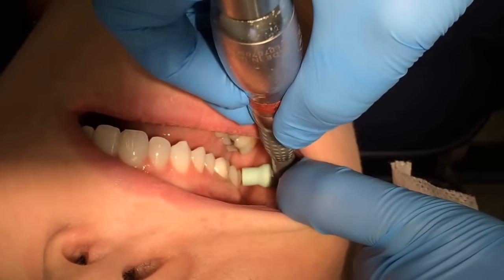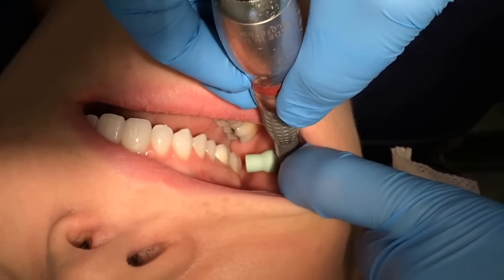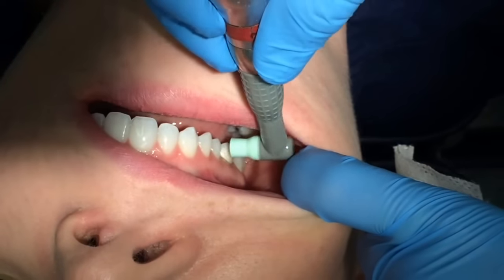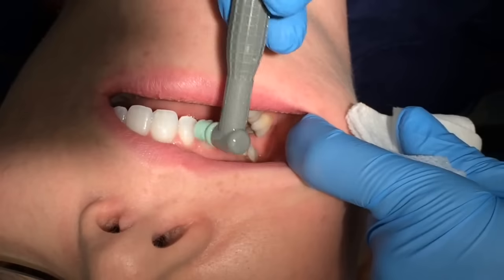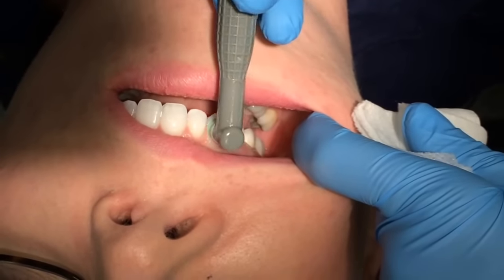I'm going to show you the whole mouth. This is one option for the sequence — there are many out there. Reload. And fulcruming on her chin using an extra-oral fulcrum.